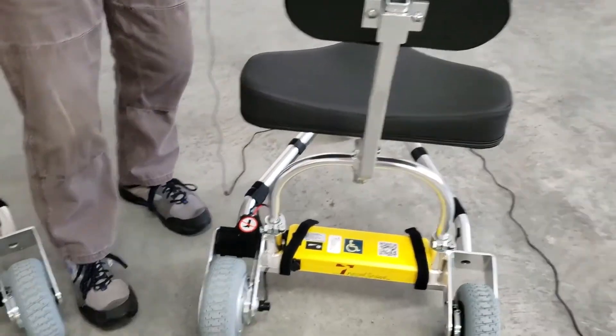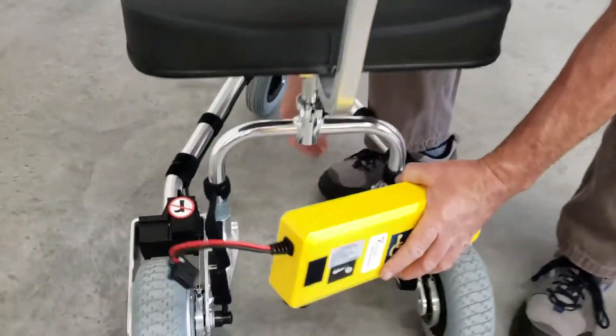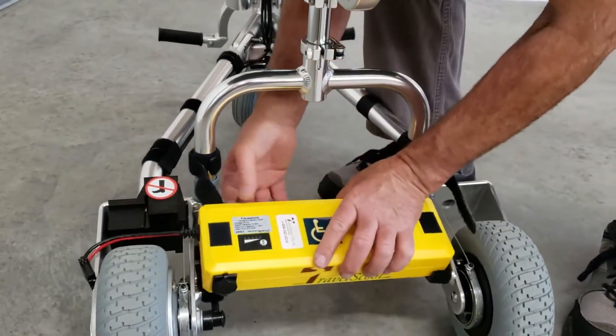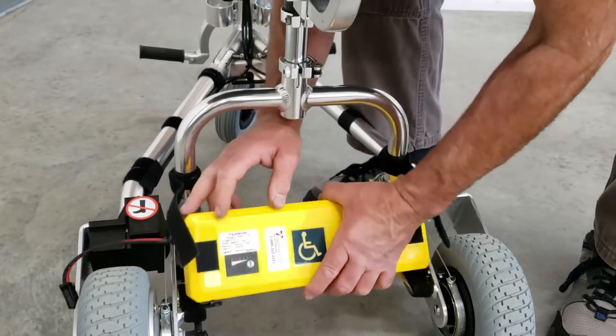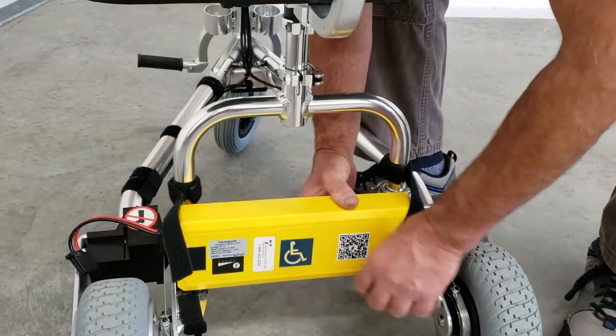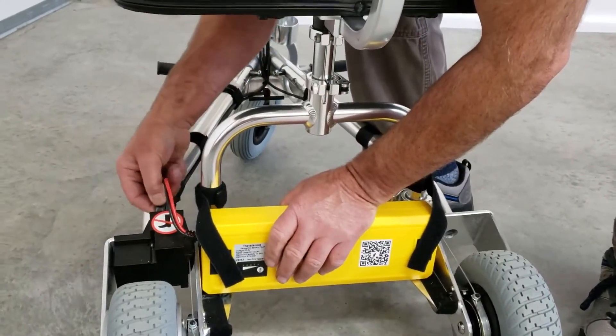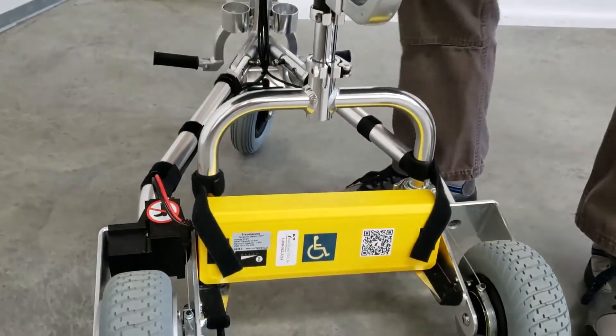If it falls out, you're doing something wrong. On the Junior, the battery is installed on edge. It does not lie flat in the tray because that would interfere with the wire. So we've just made a provision to set it on edge. Velcro, and you're ready to go.